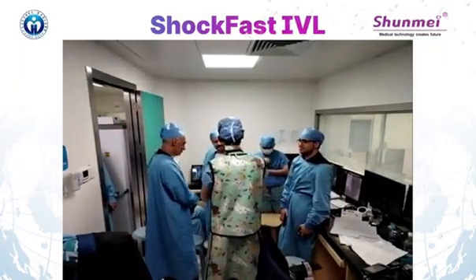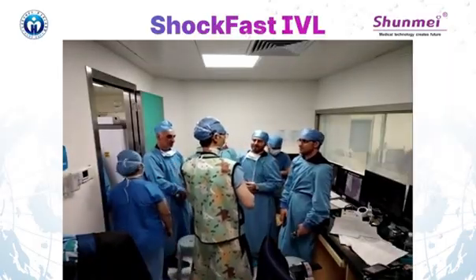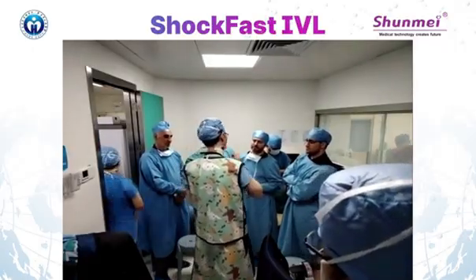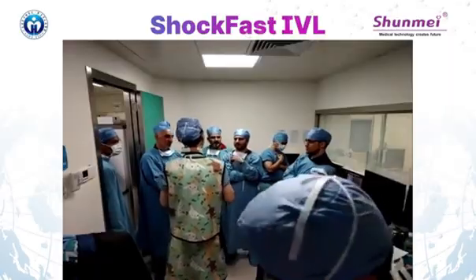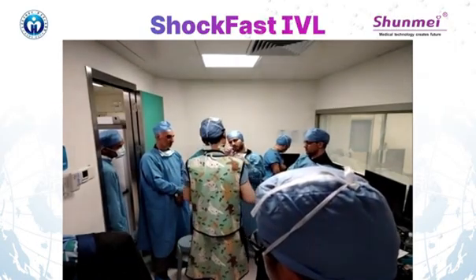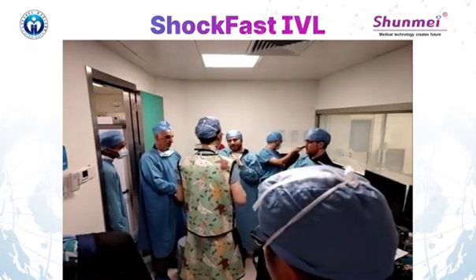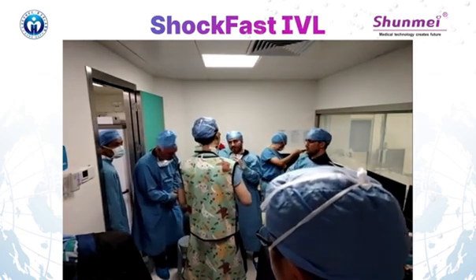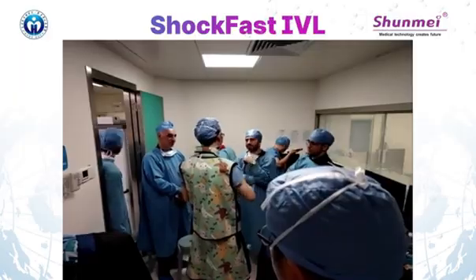With the extension guiding catheter, I just keep in mind: be gentle, be careful, don't damage the stent. But when you deliver it into the distal stent, yes, of course, after post-dilatation balloon you again use the guide extension easily. You are right. But you know what?